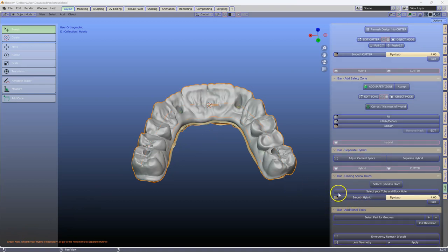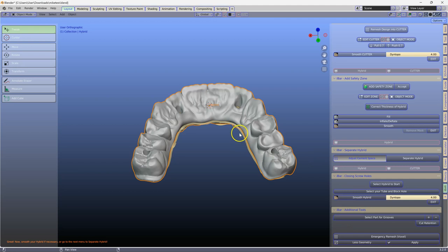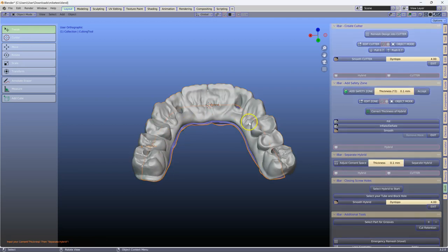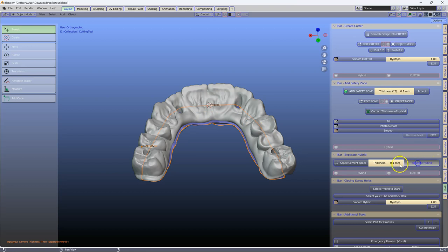Next, go to your adjust cement spacer, which will change the color of your cutting tool. Put your thickness in there, and then click on separate.